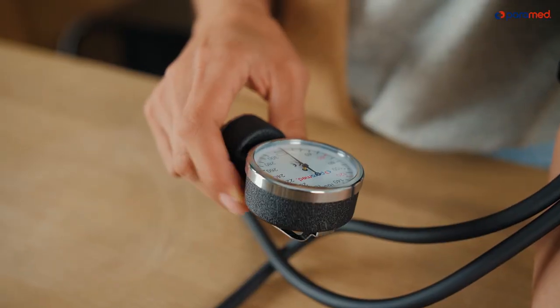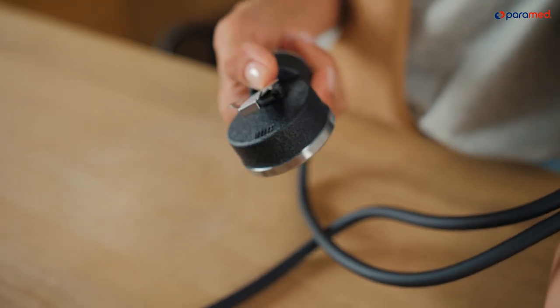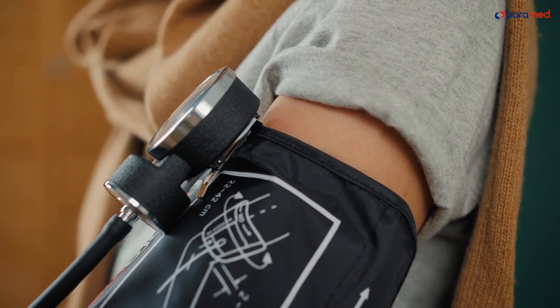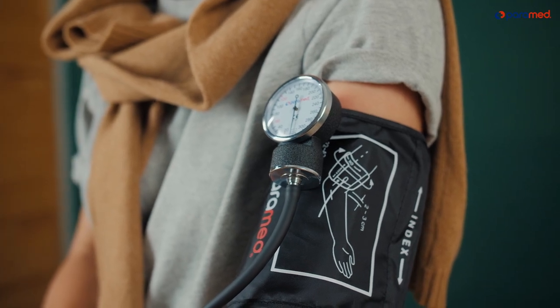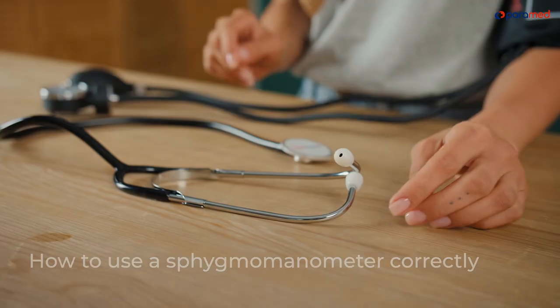The manometer has a special fastening tool so that you can attach it in a place that's comfortable for you. For example, if you're measuring someone else's blood pressure, it's convenient for the readout to be at eye level so that you can carefully monitor the pressure gauge. If you're measuring your own blood pressure, you can similarly use this fastening tool to place the manometer so that it's comfortable for you.